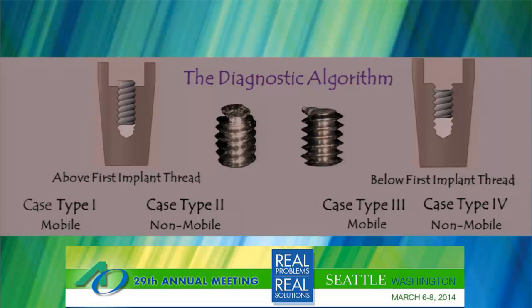On the one that's down below, the 4s, it's hard to know exactly why all these might get tight, but some of them are locked, and in my practice where someone's tried to work on them, a very common way that a screw fragment gets locked is someone goes in with an ultrasonic instrument, tries to take it out with an ultrasonic instrument, and that shot peens the top of the screw to the threads and essentially distorts the anatomy in the implant enough that it locks the screw in place.